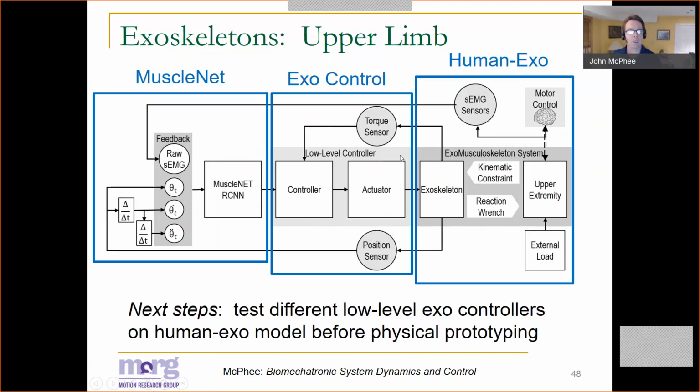And then we're going to develop an exoskeleton controller that will take as input the human torque and then augment it with some additional actuation. Very, very similar to the way that electric power steering works, similar to the way that our rehab robot works. And in fact, we're using a similar model-based control approach in order to develop these controllers.